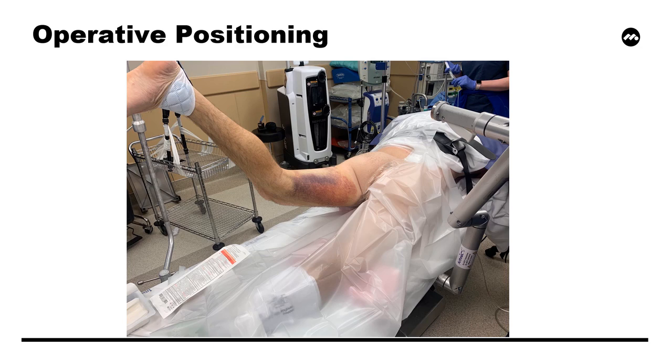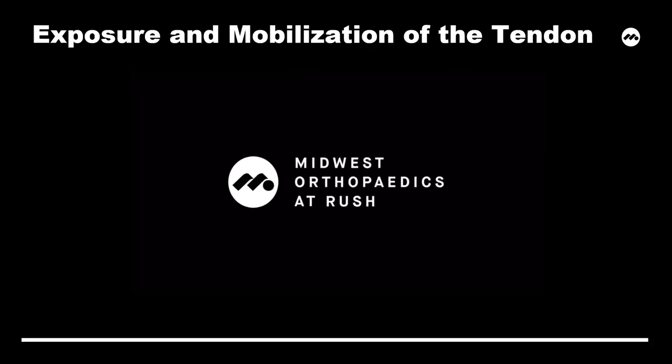The patient is positioned in the prone position with well-padded bony prominences, including those of the face and head, shoulders and chest, anterior pelvic bones, and patella. Standard prepping and draping techniques are utilized. We now present our surgical technique.